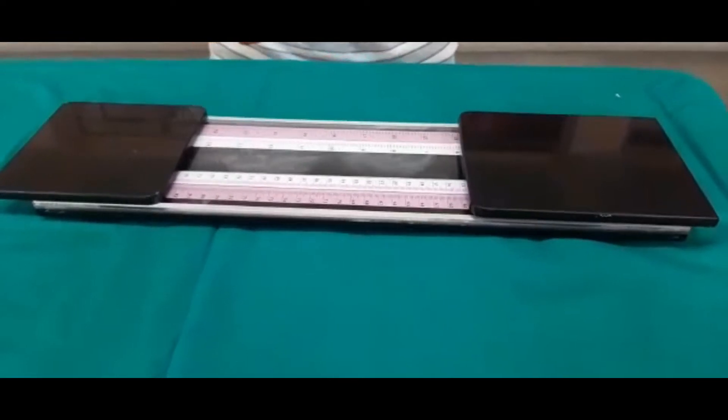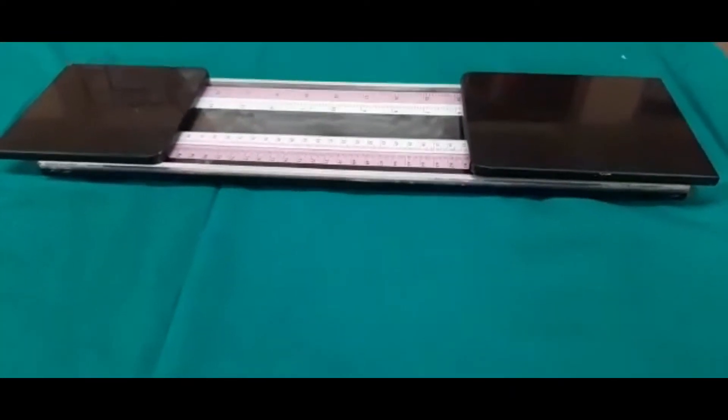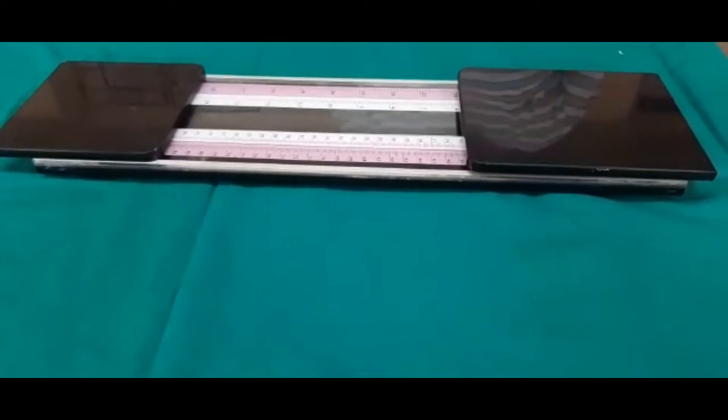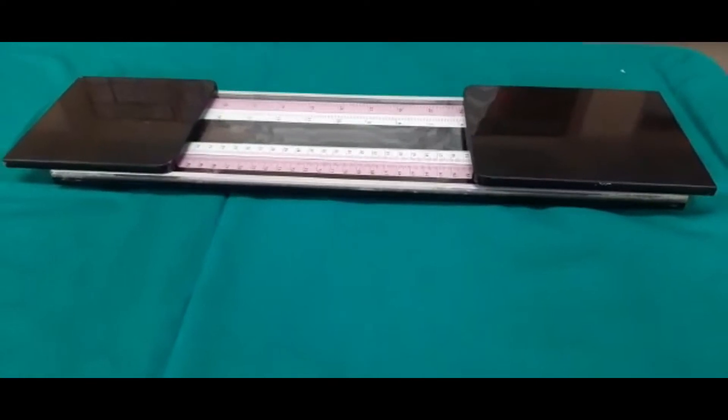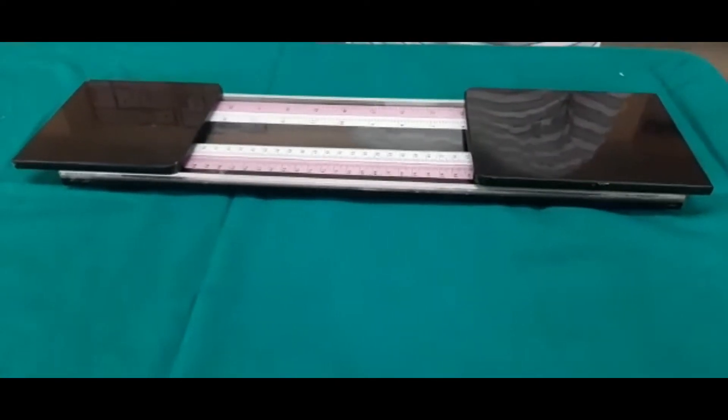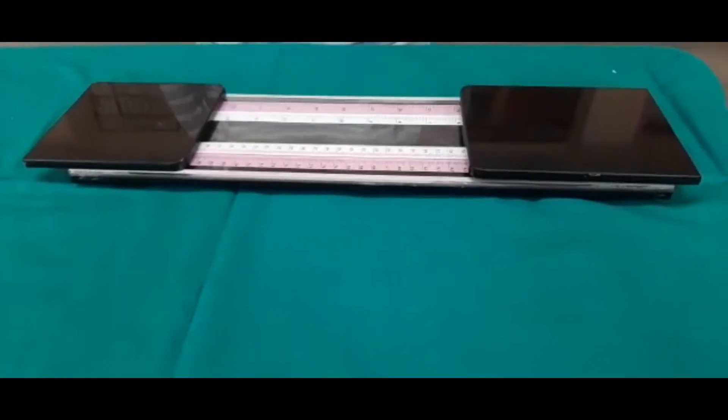You know very well the difference between length and height. Length means when the baby is not able to stand at the time of infancy, and when they are able to stand, that time we check the height with the help of a stadiometer. This is an infantometer.